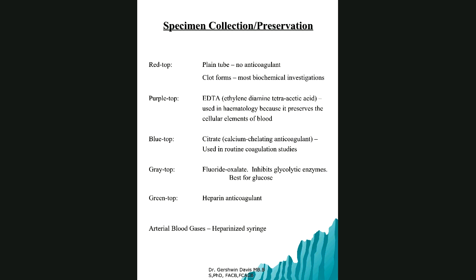Specimen collection. So we have the various color tubes, and what is the added information here? You've done this a bit in year one. But the added information is that somebody else does a presentation on tubes. You can go and read up on various types of tubes. I just want to point out one or two things that were pointed out, hopefully, in the presentation recording earlier.